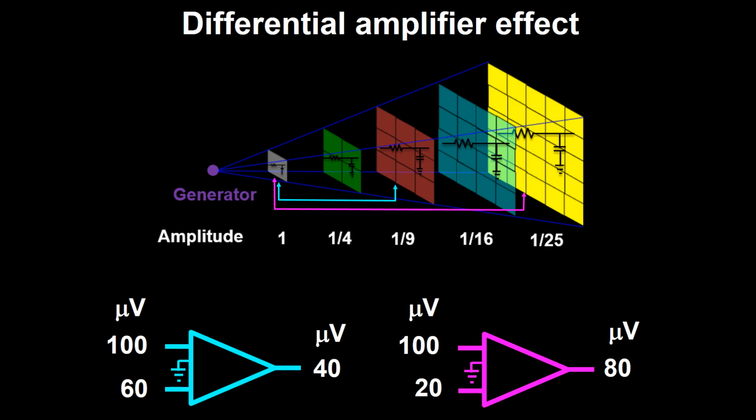The explanation I use to explain why amplitude starts dropping after 10 centimeters is that at such a distance, the electrode away from the source, the one that goes to input 2 of the differential amplifier, is getting activity from other sources that add up to a larger amplitude entering through input 2 than would otherwise if it would be dependent only on the source that is feeding the electrode coming into the amplifier through input 1.